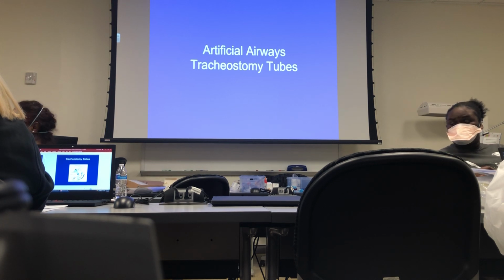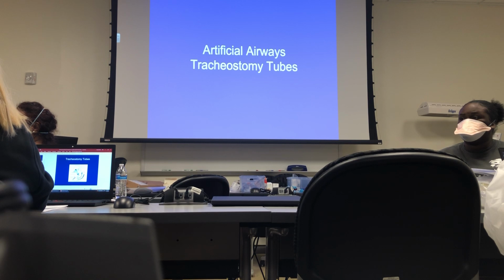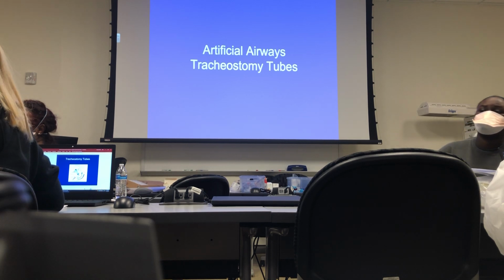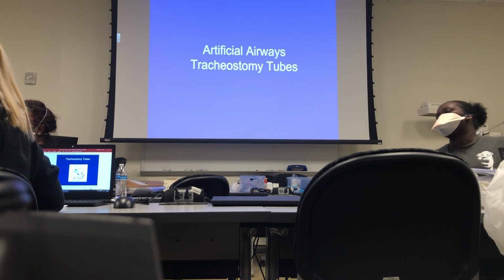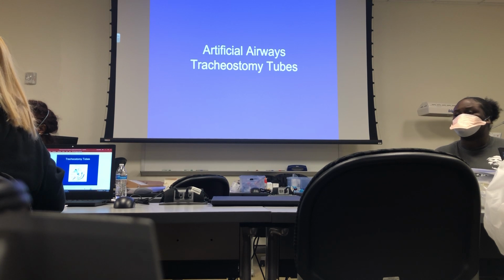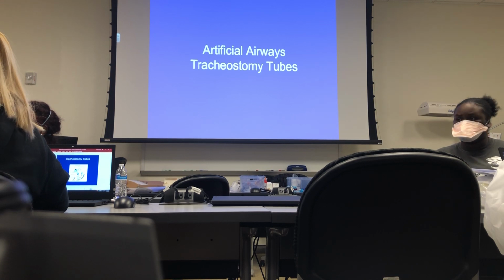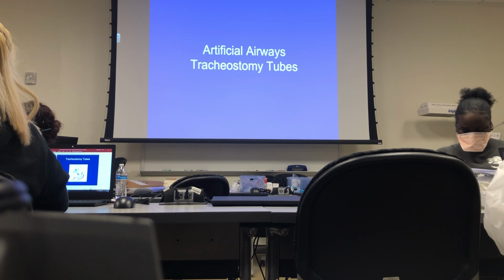They make a slit between the second and third tracheal rings. They lift up the ET tube, okay? They're looking at the trachea at that point, the inside, they lift up the ET tube so that the ET tube is above the cut. And then they insert the trach. Now, if they inserted it without this obturator, these edges could get caught in tissue. This makes for an atraumatic insertion because it smooths out the end. So the trach gets put in, the second and third tracheal rings, this comes out, the inner cannula goes in. So the obturator is used to insert the trach to prevent mucosal trauma. That's all the obturator does.